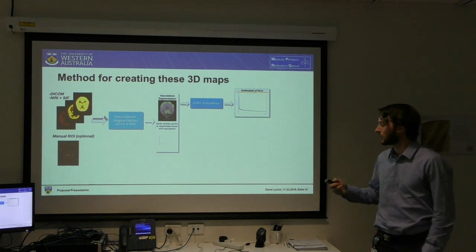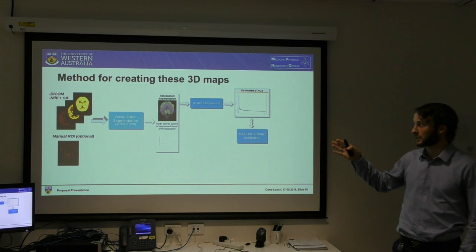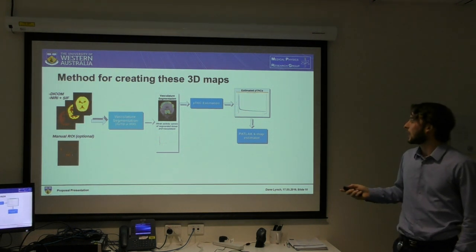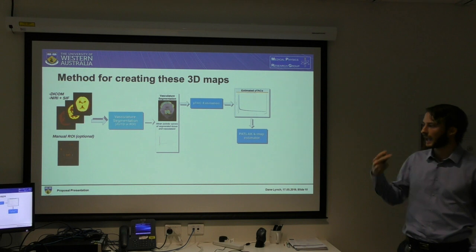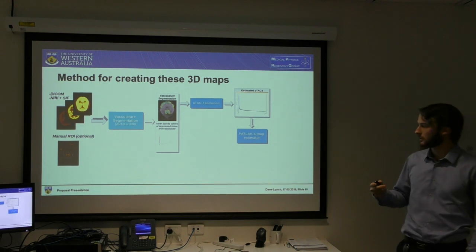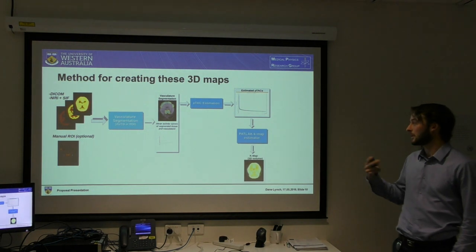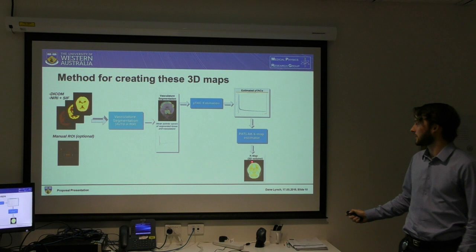Once we have those, we can apply our Patlak analysis using, this is actually a method outlined by Slicer, a program which I may be utilising. Once we have this plasma time activity curve, we can use the Patlak analysis and find our K value for each voxel. Using this, we can then remap it and replot it as a nice image.